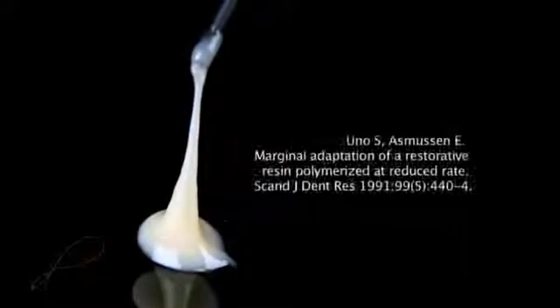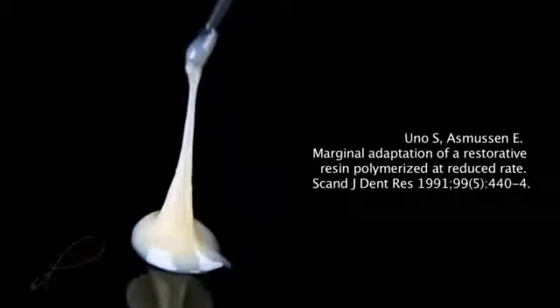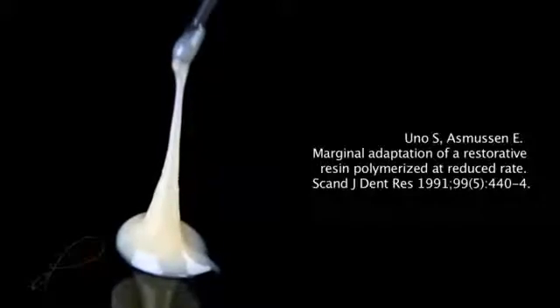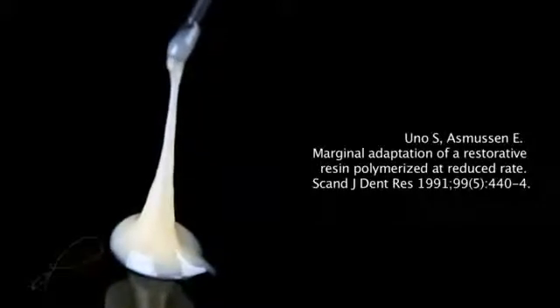The material is thixotropic. This property allows the material to structurally break down so it flows through the syringe tip when stressed, and then it restructures and becomes more viscous. Uno and Asmussen suggest that using a slower polymerization causes an improved flow of molecules in the material while decreasing the polymerization shrinkage stress in the restoration. The mylar strip was removed and the interproximal region was inspected for any residual composite resin tags or overhangs.